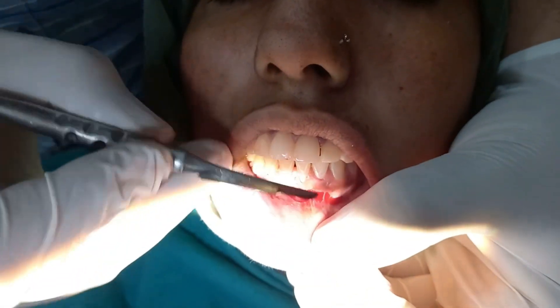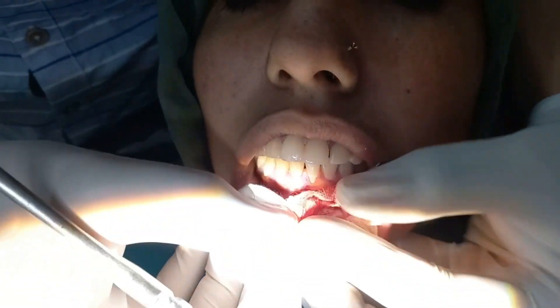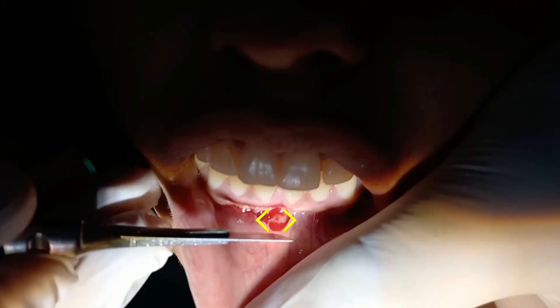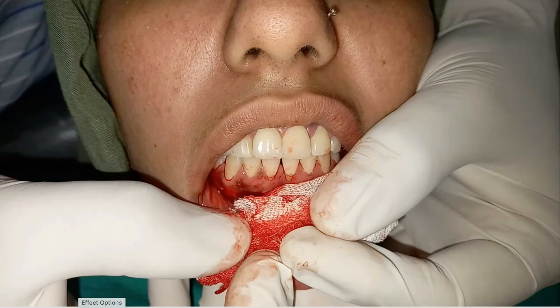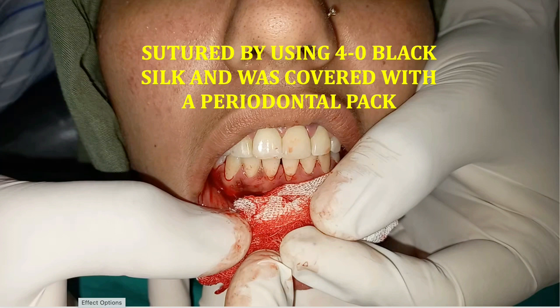Then we perform blunt dissection on the bone so that we can relieve the fibrous attachment. This is a case of multiple labial attachments — as you can see there are two or three attachments — so we give a blunt dissection to relieve the other fibrous attachments that create pressure. After resection of the triangular part, the wound will be somewhat in a diamond shape. We suture the diamond-shaped wound and cover the area with a periodontal pack.